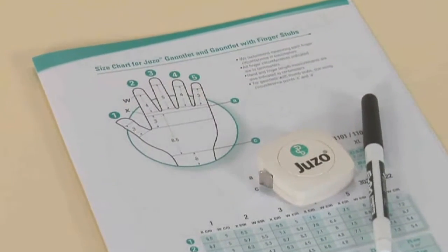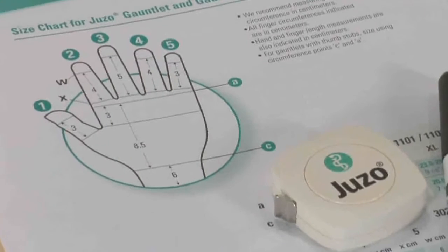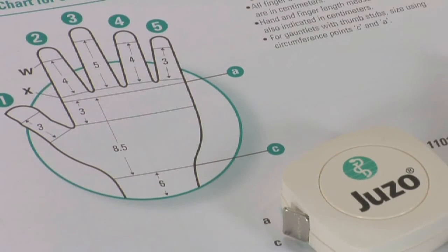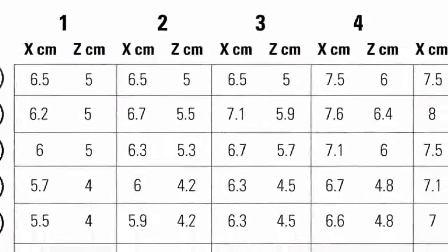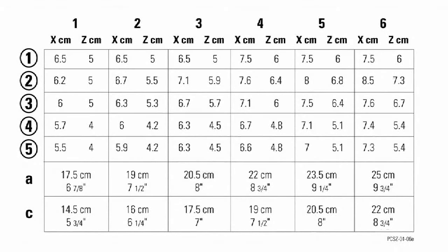Let's get started. When taking measurements, it's important that the edema is at its most reduced state, usually first thing in the morning or at the end of treatment. Make sure you have your Juzo measuring tape, washable marker, and size chart handy. Juzo gloves and gauntlets come in 6 standard sizes. To determine whether a patient can wear a Juzo standard size garment, compare the points you measure to the Juzo size chart. Standard sizing is determined using point A and point C plus fingers.